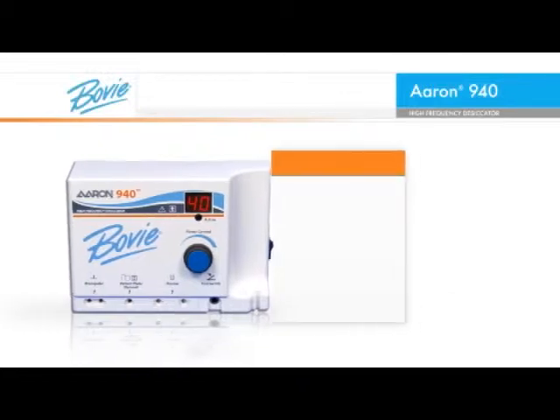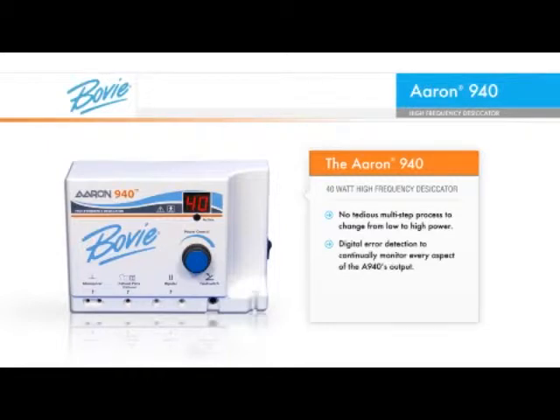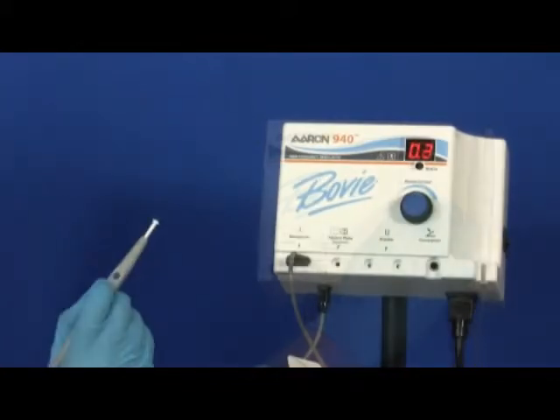The Aaron 940, Bovie's 40-watt high-frequency desiccator, forever removes the need to go through a tedious multi-step process to change from low to high power. This generator has digital error detection and continually monitors every aspect of the A940's output. It allows doctors to change power settings with one action, using the rotary power control dial or the up-down buttons on the autoclavable handpiece.